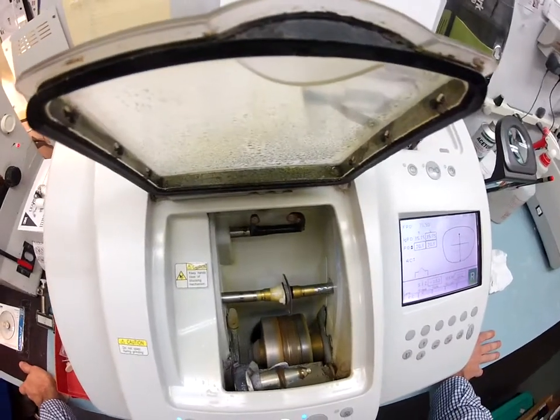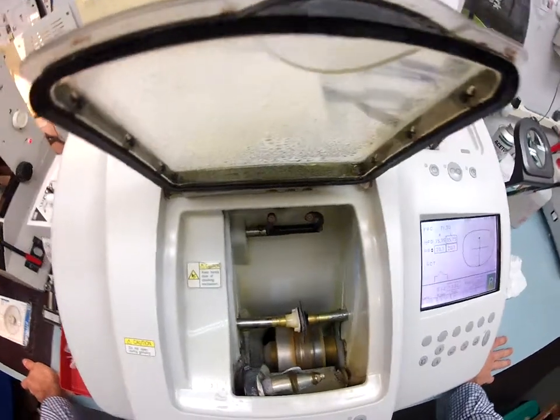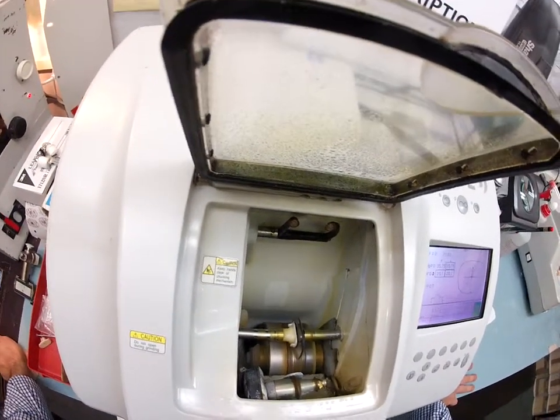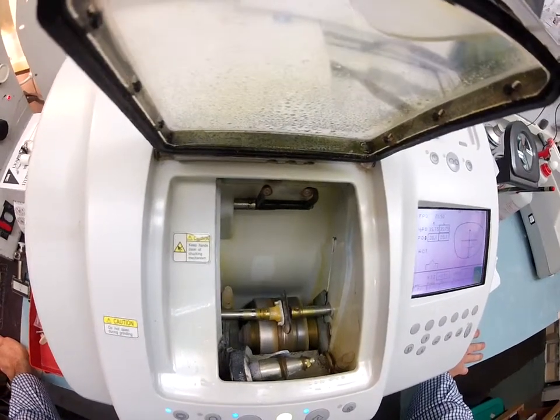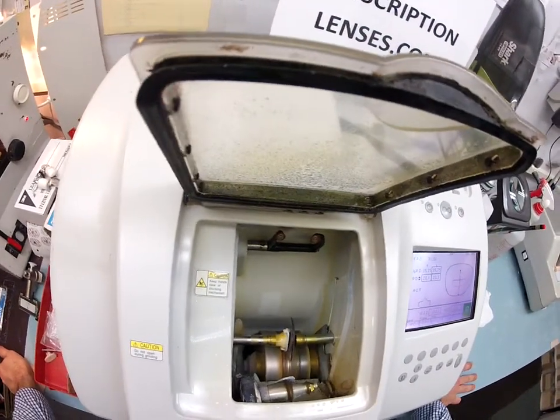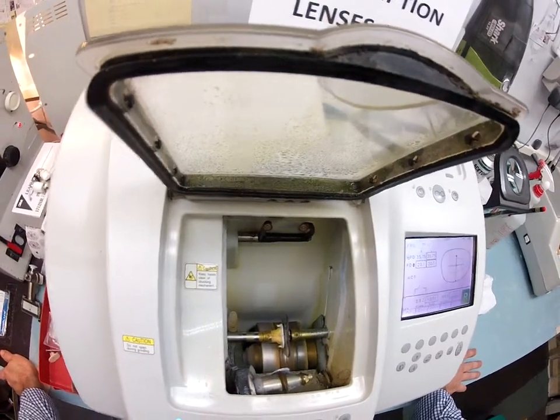And hopefully I can do all of this in 20 minutes, because if I don't, YouTube is going to chop this video into 2. And I still want to show you as your lenses turn dark. I'm going to show you what they look like clear, and then I'm going to show you what they look like dark. But once I get the size down just right, I'm going to flip it over and cut the left lens. I shouldn't have that problem with the left.